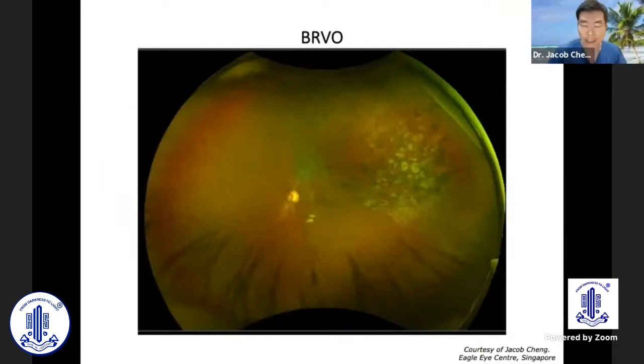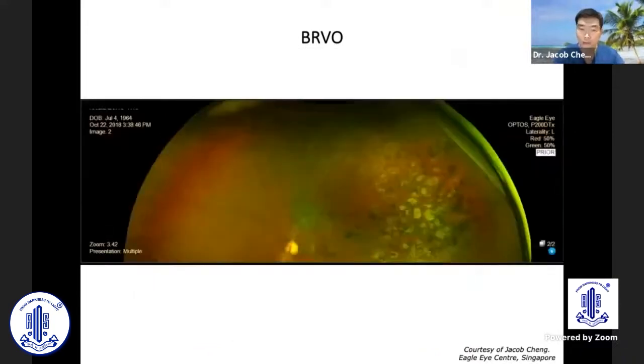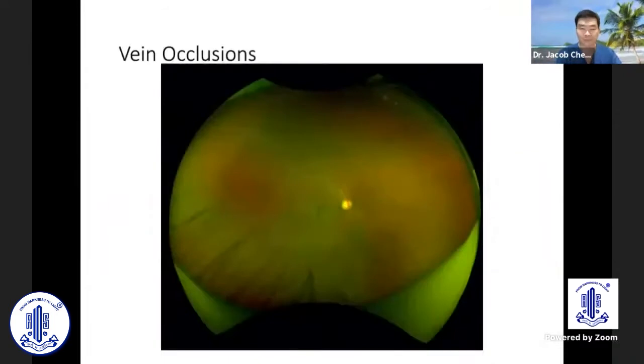The patient presented symptomatically with blurring of vision, found to have branch retinal vein occlusion on the superior temporal aspect of the left eye, successfully lasered, as you can see here. So this is a close-up view of the successful sectoral laser for this branch retinal vein occlusion, green channels showing the sclerosed vessels as well as the extent of the laser, both surrounding the sclerosed vessels as well as to the far periphery.